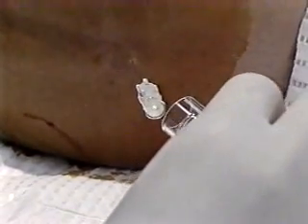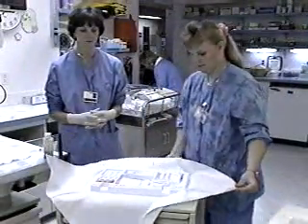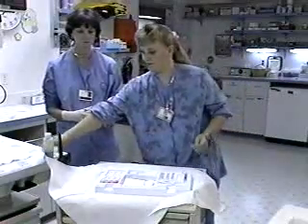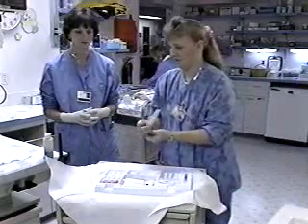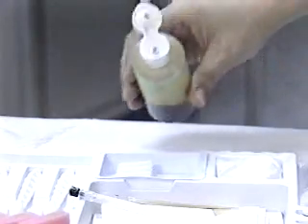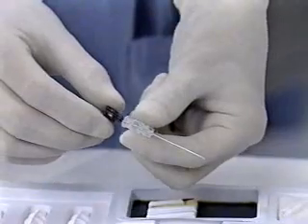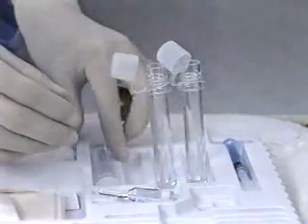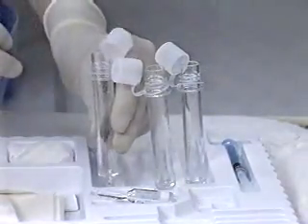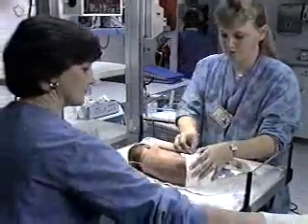Because the infant has to be restrained during the procedure, it's very important to complete as many preparations as possible before beginning the procedure. As the infant is being positioned, the practitioner or the assistant opens the sterile prepackaged spinal tray, pours betadine into the well, puts on sterile gloves, and arranges the equipment on the tray. The spinal needle is inspected for ease of withdrawing the stylet. The tops are unscrewed from the CSF tubes, and the tubes are placed upright in their holders. The practitioner then steps into position at the patient's side.